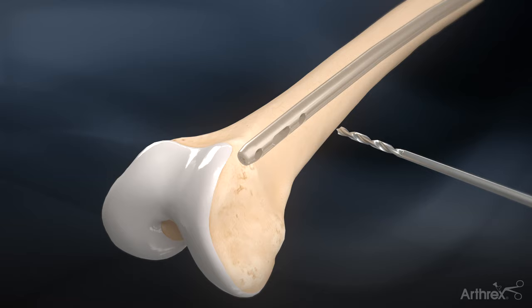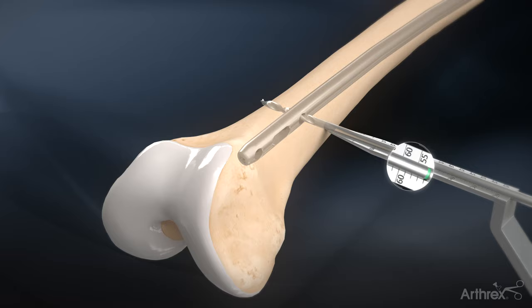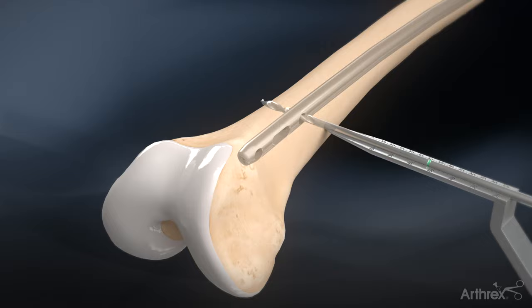Using a perfect circle technique, drill bicortically through the distal femur with the short 4 mm drill bit. Measure the screw length using the green line on the drill bit referenced off the distal depth gauge.